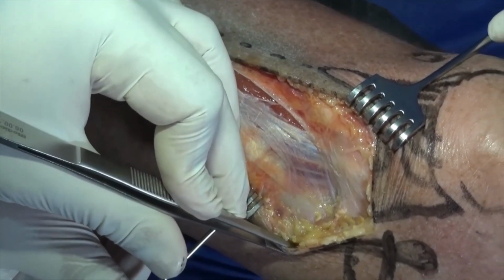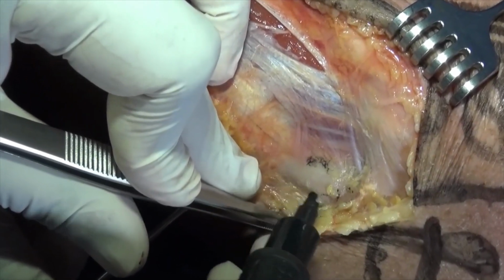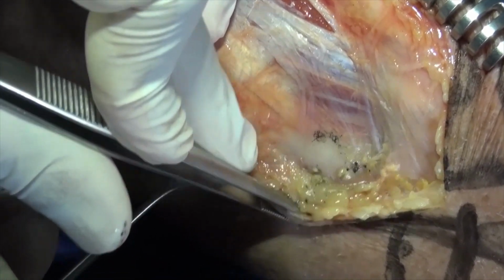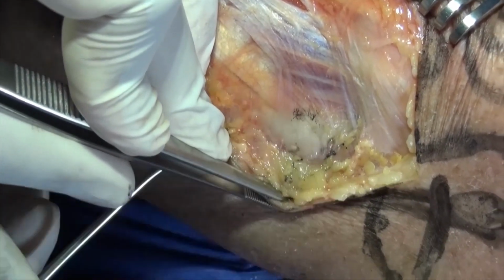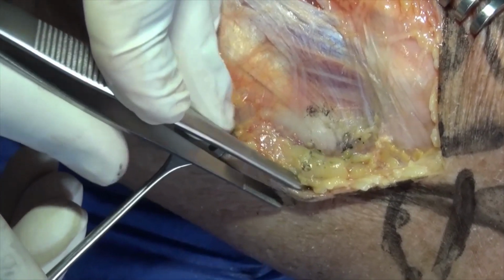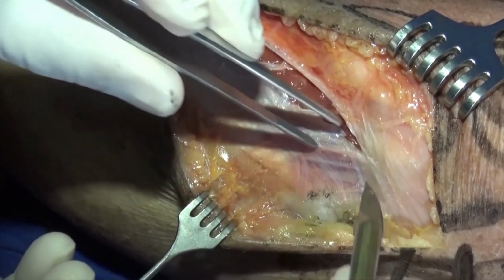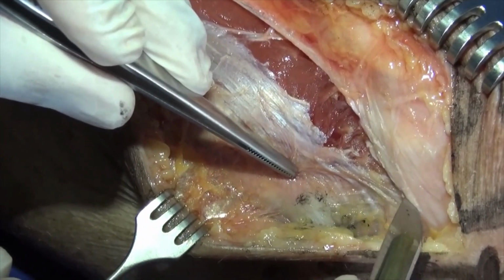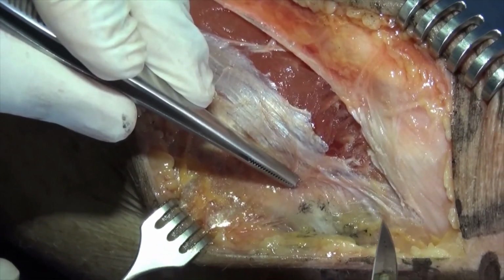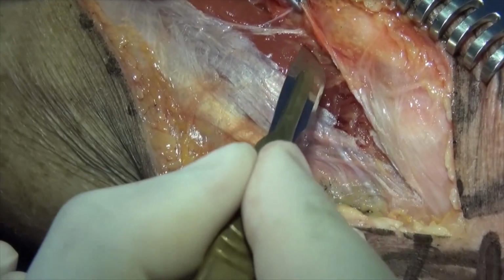you can see the fibular head coming into view there, this white structure, and I'm aware that that is where I had marked it beforehand, and I know the fibular collateral ligament will be running here, so I'm not going to transgress that. But what I'm going to do is to open up in the line right up to here, which is as far as I need to go. I don't need to go any further if I'm just going to deal with an anterolateral fragment.